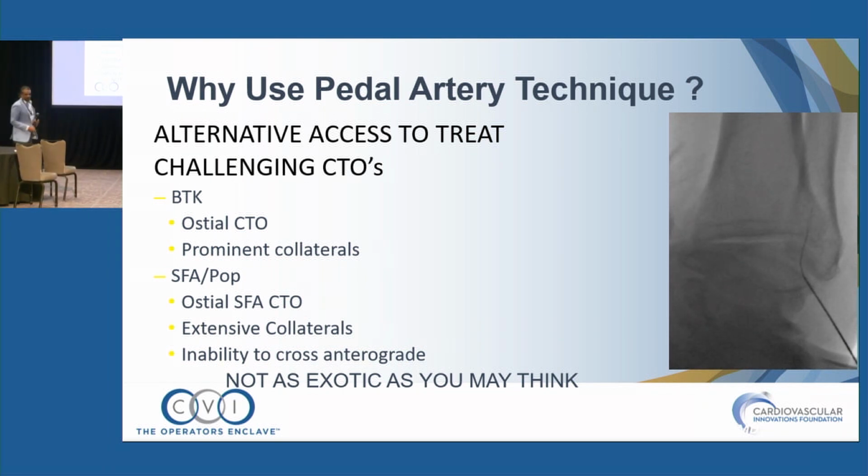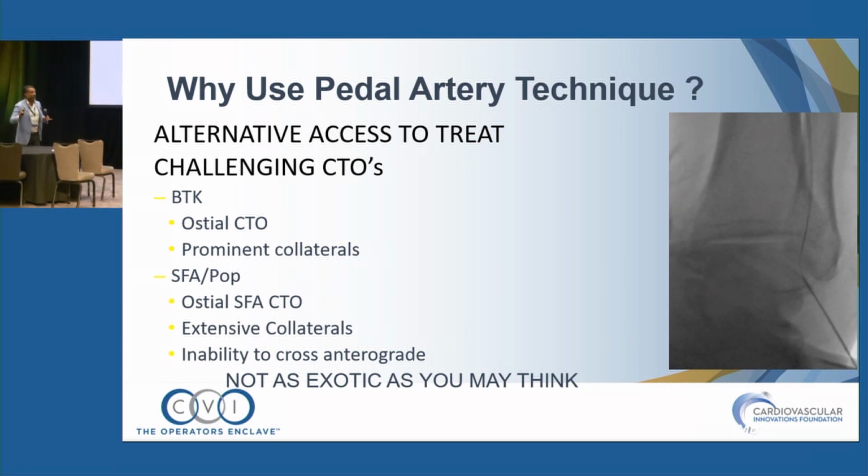So why use pedal artery access? People think that it's this crazy, amazing, exotic technique, but I think about it as the radial of the foot. Back in the day, when I was in training, everybody was scared of doing radial interventions or radial access because they thought you're going to hurt that artery and you shouldn't be accessing the radial arteries. And now it's common state of what we do. But just because you get pedal access doesn't mean you're going to cross a lesion. You still got to cross a lesion. It's just increasing your odds of being able to cross it sometime, antegrade, retrograde, and connect the dots. I call it the finger of God as you come together.